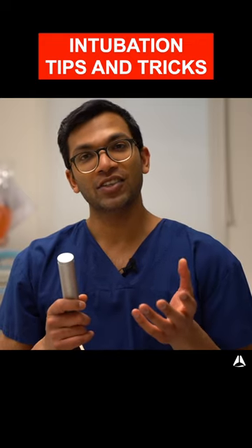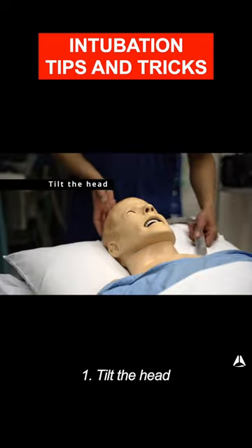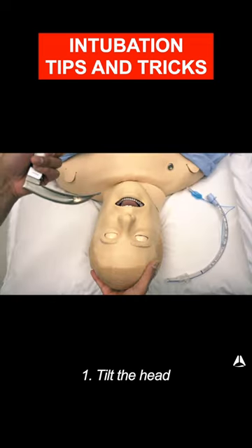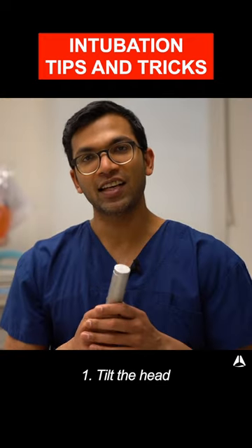When I'm intubating, the very first thing I do after the patient's anesthetized and paralyzed is I tilt the head back. What that does is it tilts the head on the atlantooccipital joint, which opens the mouth slightly and also gives me a better aperture down into the trachea.